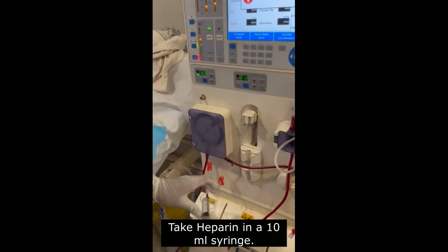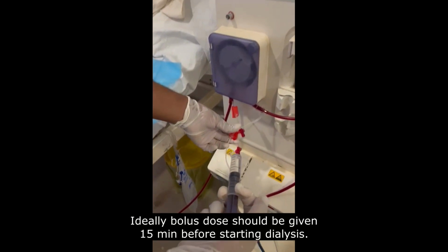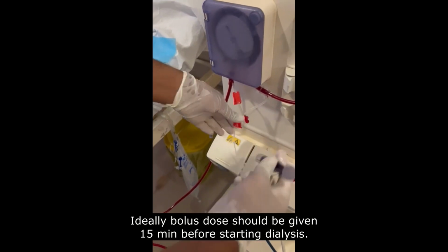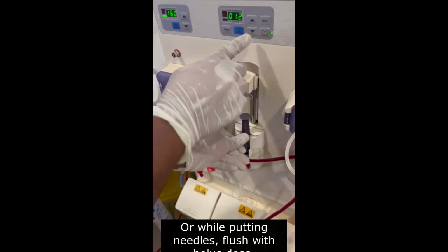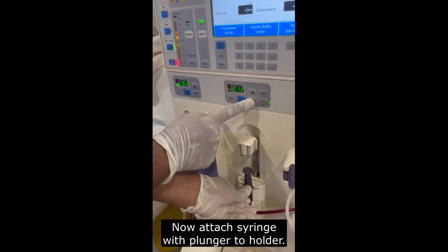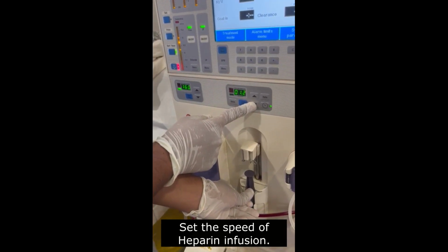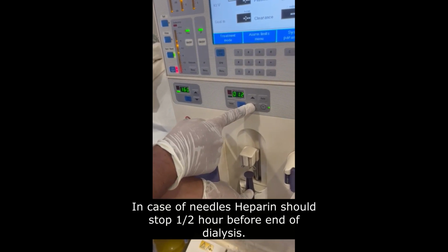Take heparin in a 10 ml syringe and give a loading dose or a bolus dose of heparin. Ideally it should be given 15 minutes before starting dialysis, or while putting the needles, flush with the dose. Now attach the syringe with the plunger to the holder and set the speed of the heparin infusion.